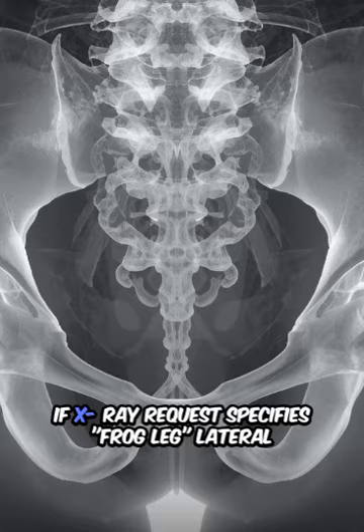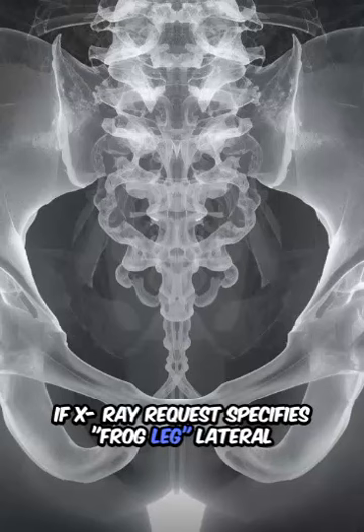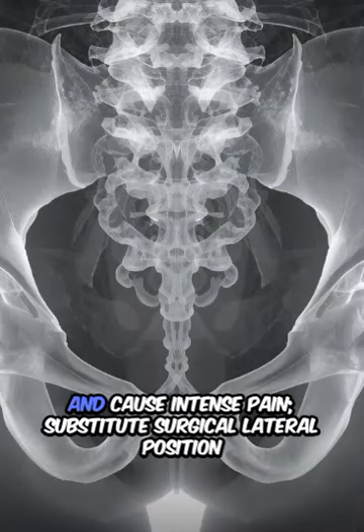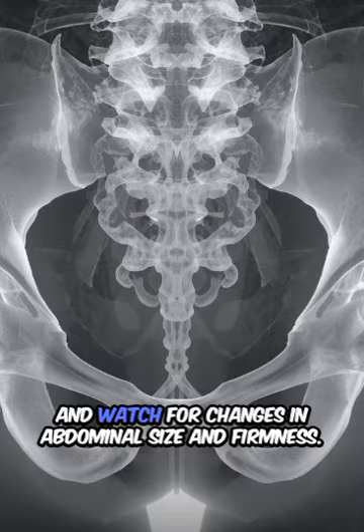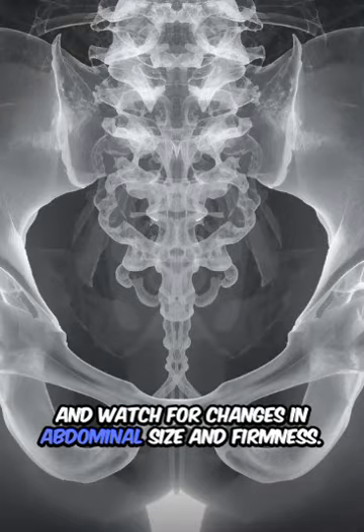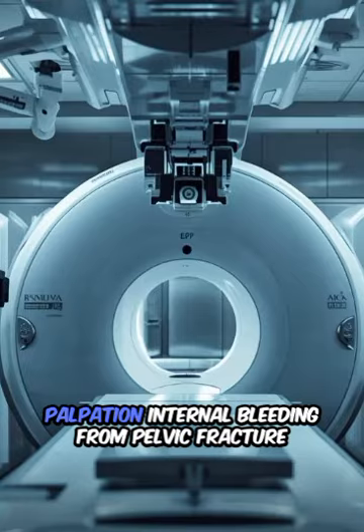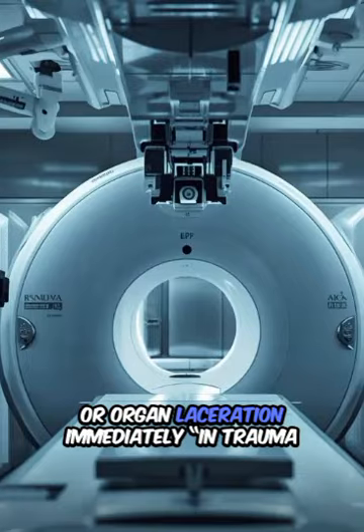Only if the X-ray request specifies frog leg, lateral projection of hip, which would exacerbate the patient's injury and cause intense pain. Substitute surgical lateral position. Watch for changes in abdominal size and firmness, increasing abdominal distension and firmness to palpation: internal bleeding from pelvic fracture or organ laceration. Immediately.